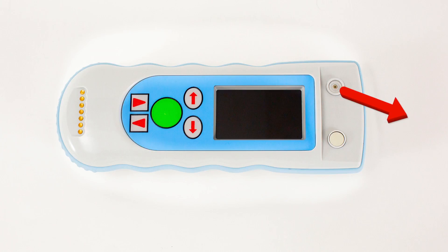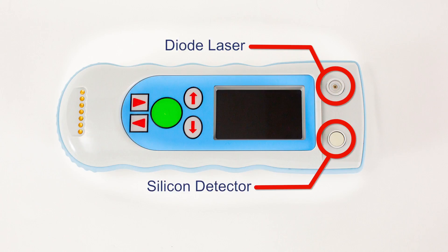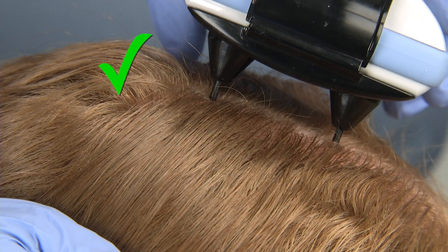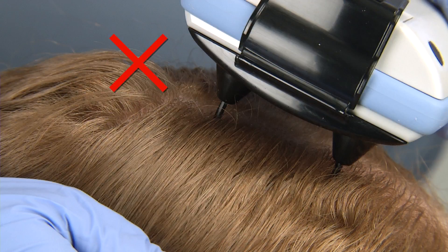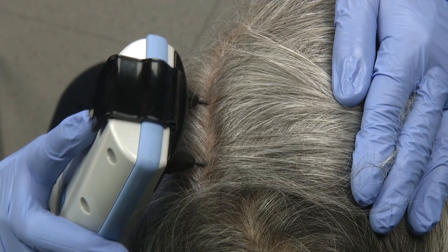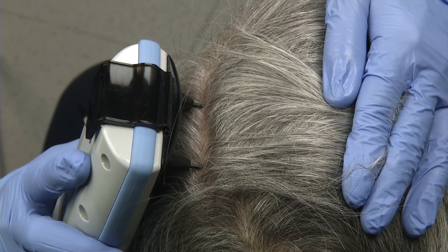The Infrascanner's near-infrared light comes from a diode laser and reflects back to the silicon detector. It is essential that scans be performed in a manner that ensures constant and consistent scalp contact with both optical fibers simultaneously, and that hair does not interfere with the laser's signal. Make sure no hair is caught under the fiber tips of the shield and that both tips are touching the scalp at all times during the measurement.